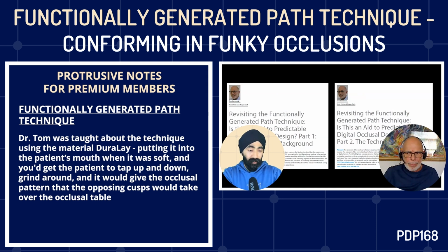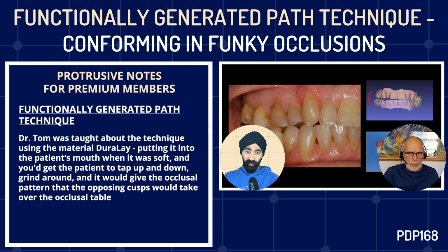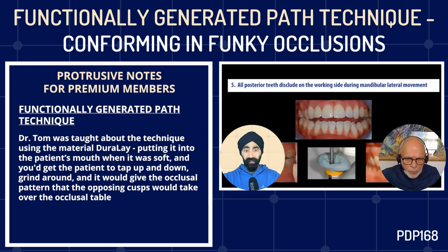When you do a single unit crown on a lower molar, for example, or an onlay, which is more fashionable these days, and you are going to take impressions or a scan, and it's a nice occlusion, the technician has an opportunity to wax it up or digitally wax it up and follow the contours of the adjacent teeth and look at the opposing tooth and really get a reasonable guess so that it fits first time.